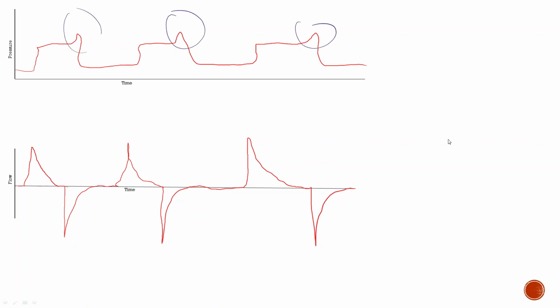And yeah, you can see them up here, these little peaks. It's a sharp down. You can see it better here, sharp down expiration before the inspiratory time is even over. So you're saying you would actually increase that? It would decrease I-time. You want to get rid of this part of the pressure control curve, because the patient is exhaling before the I-time finishes, right? Yeah. Is that what you said? I'm sorry, I don't remember.